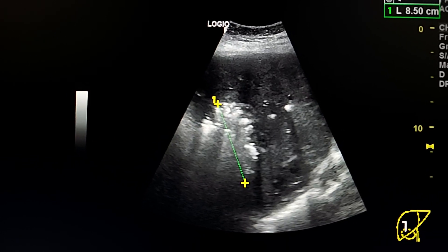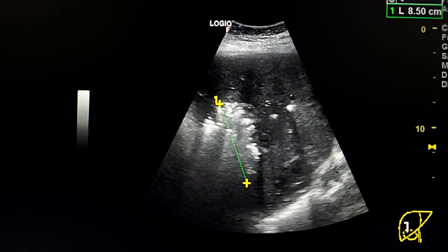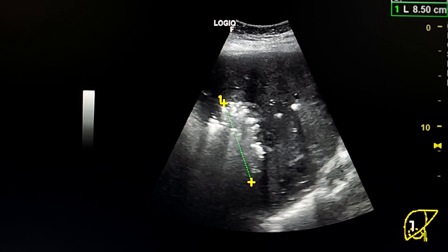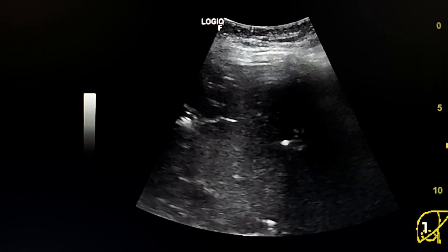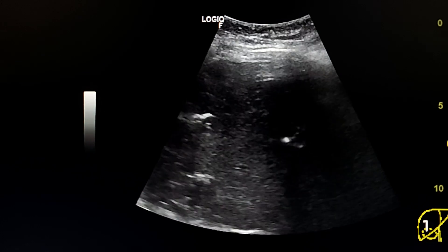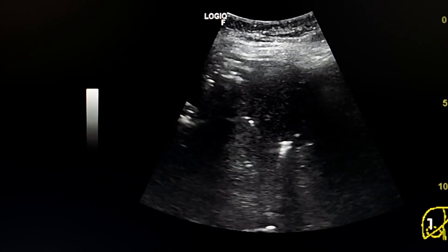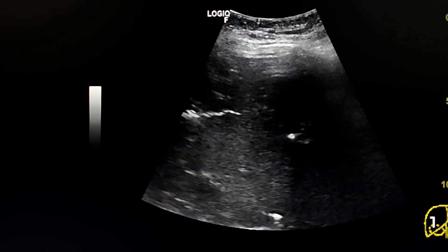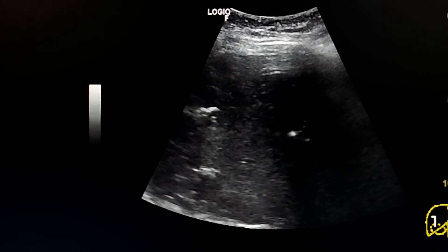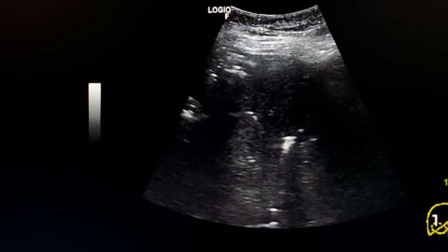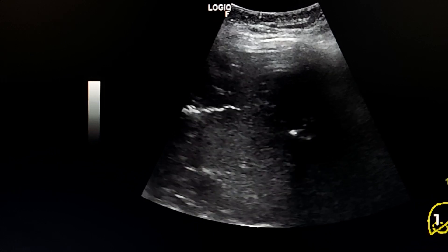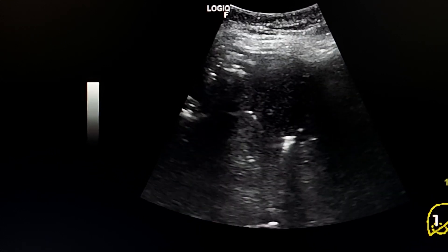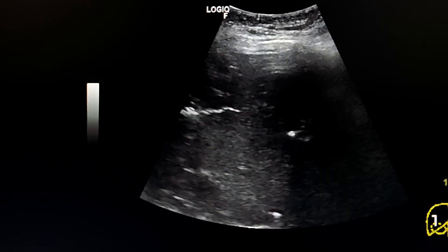This is the hepatic abscess. Here we see movement of gas bubbles through the hepatic veins.